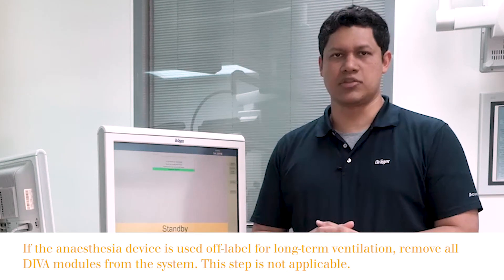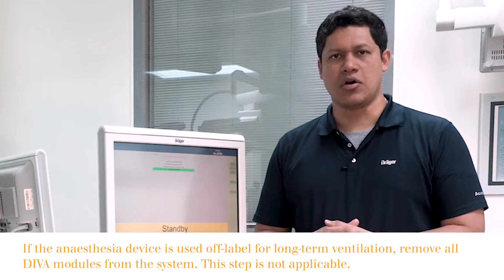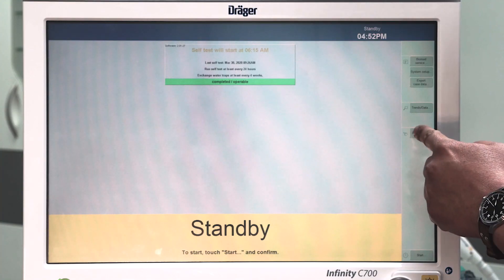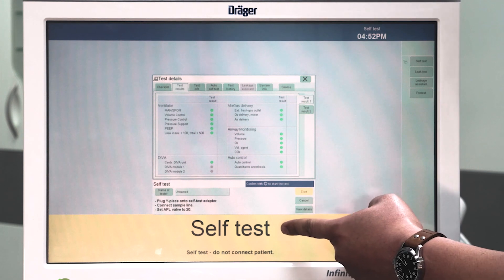The objective of this video is to show you how to perform the self-test and the leakage test on the SUS family anesthesia devices. The self-test should be performed every 24 hours. To do so, while in the standby display, you press the device test button and you will be automatically guided to the self-test.